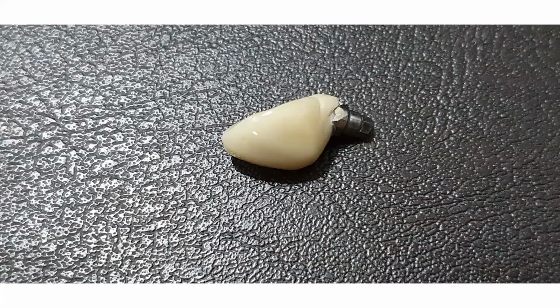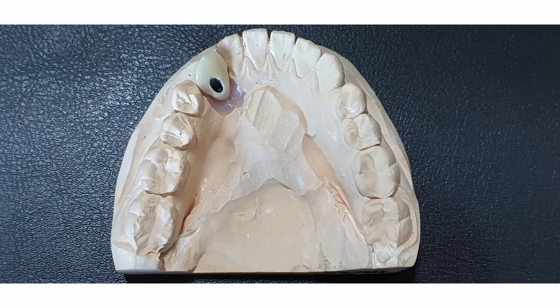It's going to be a screw retained crown on our abutment, and you can see we have a locking abutment. We have the same configuration of the hex. This is the area which locks into our implant, and then we start to build our abutment coming up like so. And here is our finished crown, ready to be screwed into place the next time we see the patient.